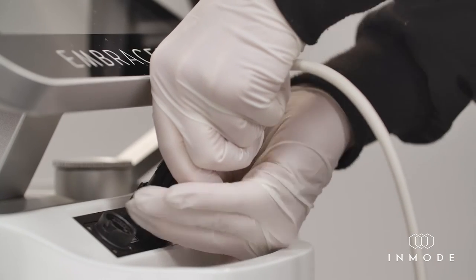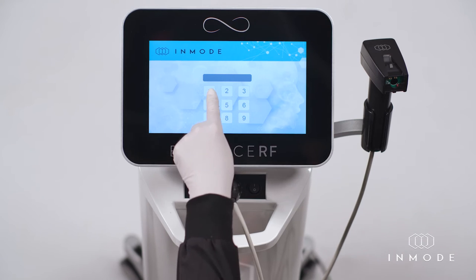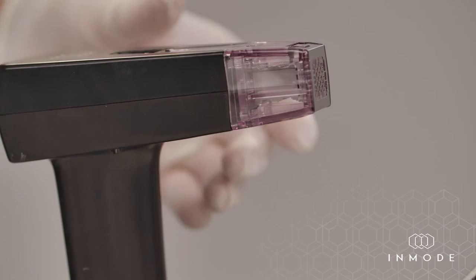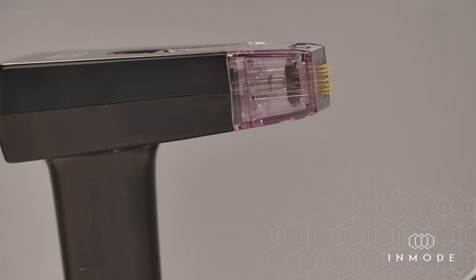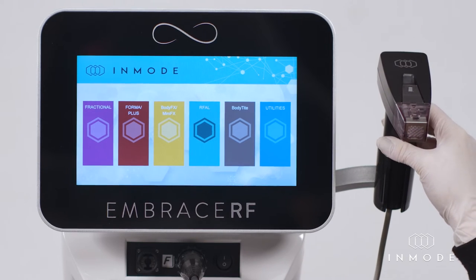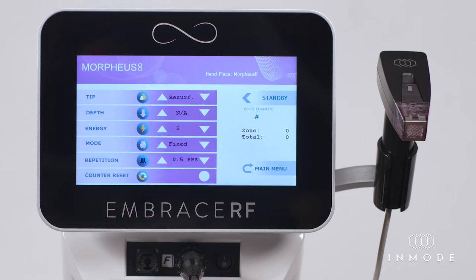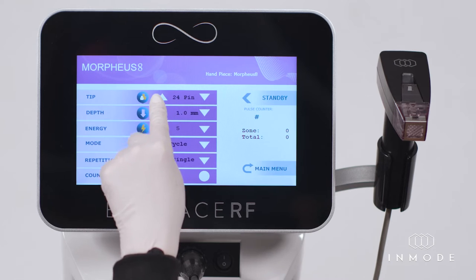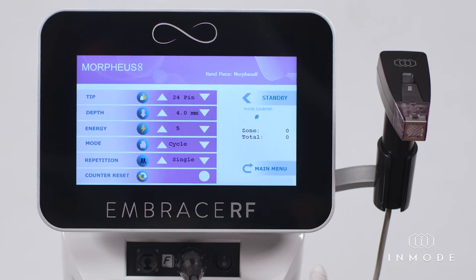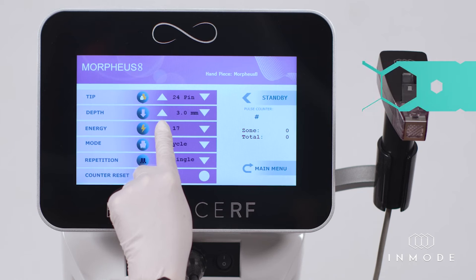Treatment procedure: Connect the applicator to the system and turn on the system. Insert the code to unlock the system. Connect the tip to the Morpheus 8 applicator prior to treatment to allow the system to perform a self-test. If both Morpheus 8 and Fractura are connected, the system will activate the Morpheus 8 by default. Select the fractional icon on the menu screen and select the correct tip with which you are currently working, as the system does not recognize the tip automatically. Adjust settings based on the parameter recommendations as presented in the operator manual and the quick reference guide.